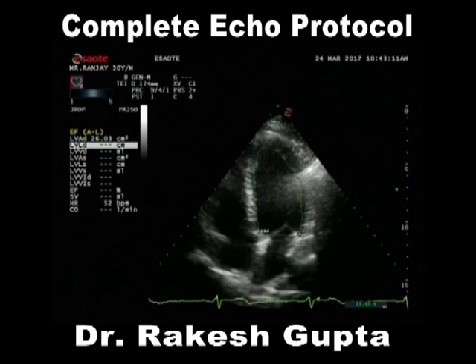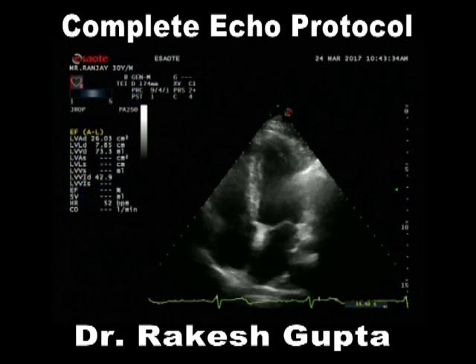and this is what I have done. I am trying to trace the endocardial delineation, or in other words, the black and white interface. Black is LV cavity, white is the endocardial margins. Once we have taken an area, you have to take a length that gives you a volume. Look, his end diastolic volume is 73 ml.